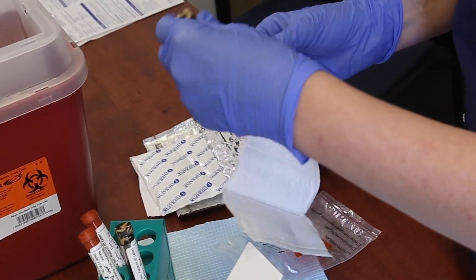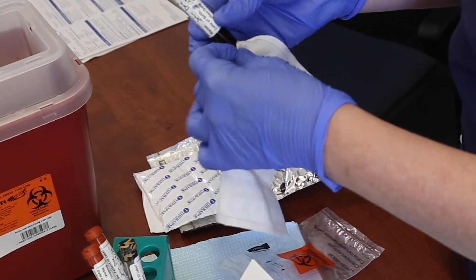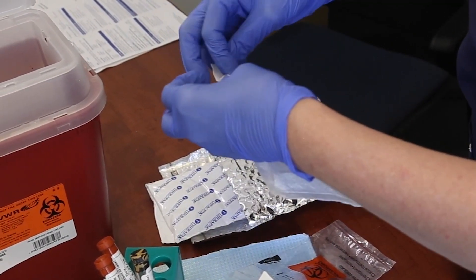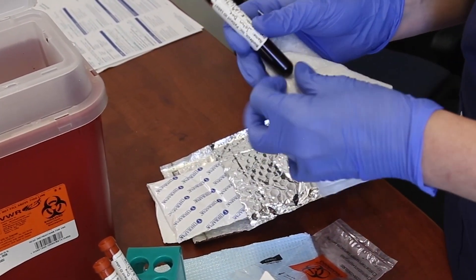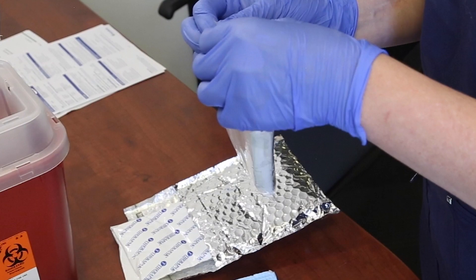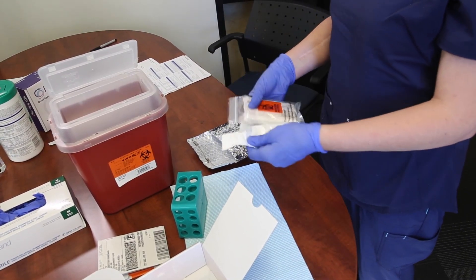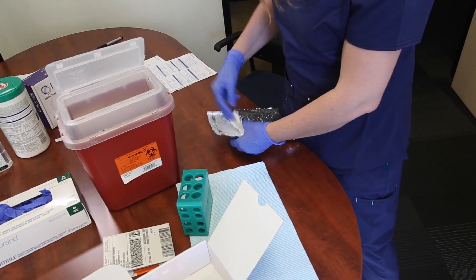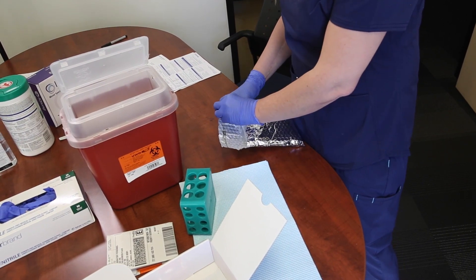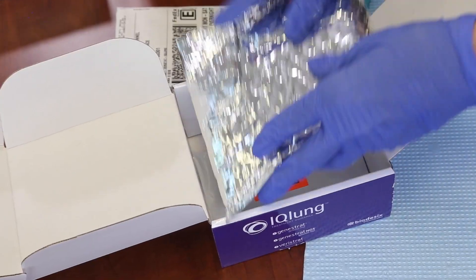Place the two black and tan and two brick red topped blood collection tubes into the absorbent sleeve, ensuring that all blood collection tubes have completed patient ID labels attached. Then place the absorbent sleeve into the biohazard bag. Place the biohazard bag inside of the gel wrap, then place the gel wrap inside of the foil pouch. Remove the adhesive cover strip and seal the foil pouch, then place inside of the kit box.